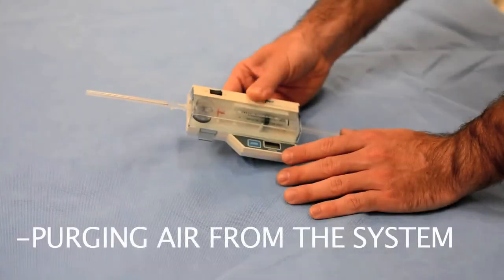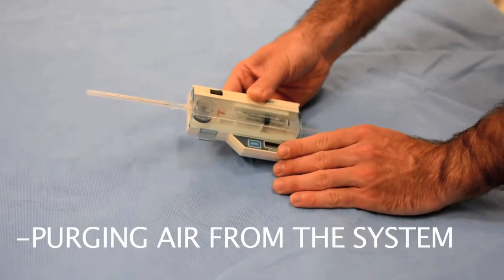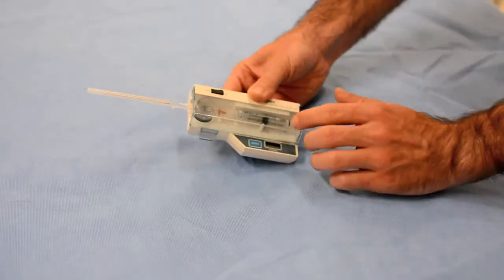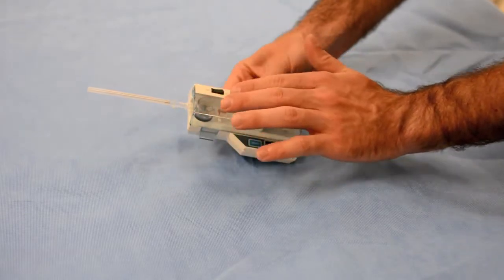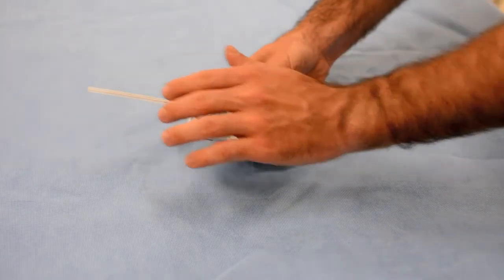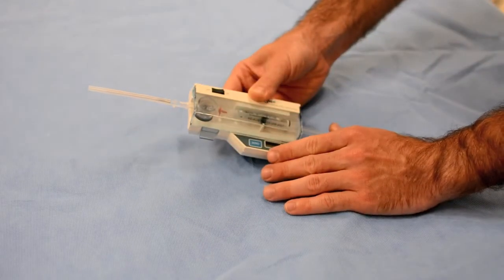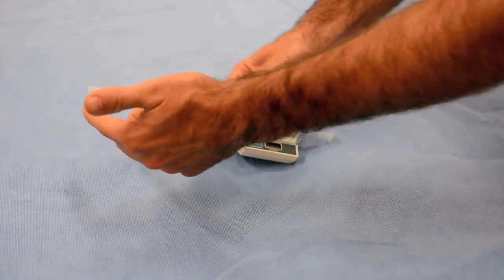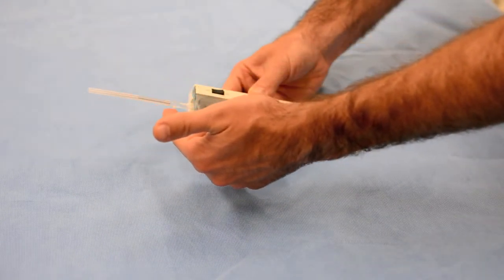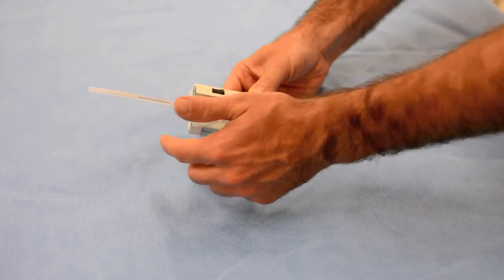The next step is purging the air from the pressure sensing system. This will be done by depressing the syringe at a 45 degree angle and allowing all the air bubbles to come out of the pressure coupler and the syringe. Avoid saline tracking back down along the syringe into the sensor.